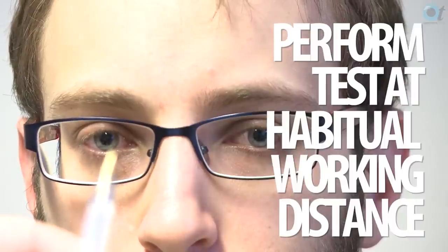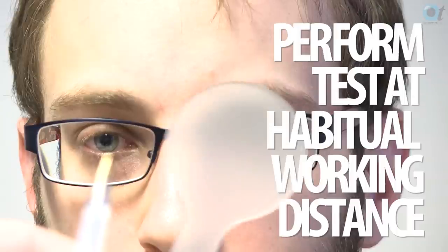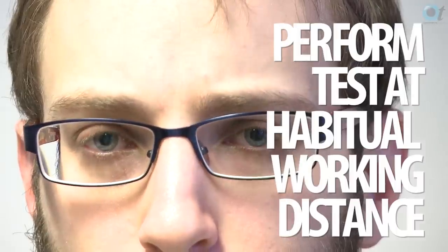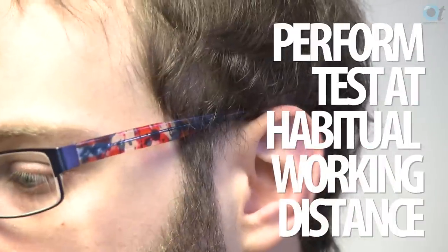At near, most people think you should do it around 40 centimetres, but of course the best distance to do a near cover test is the habitual working distance of the patient. And don't forget, you can do a cover test at intermediate as well as at near. So if the patient's complaining of asthenopic symptoms for their computer screen, do it at 70 or 80 centimetres if that's where the screen is placed.